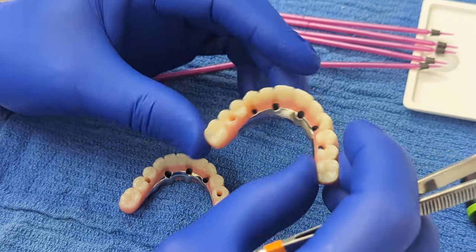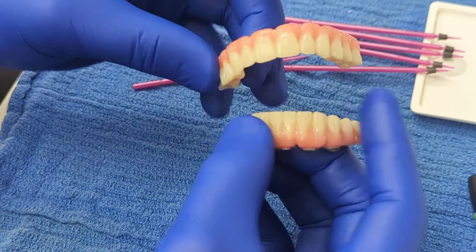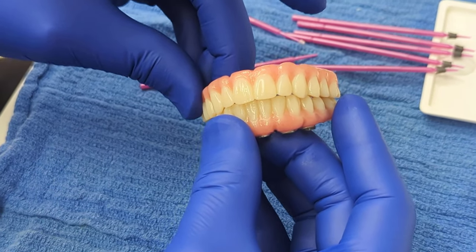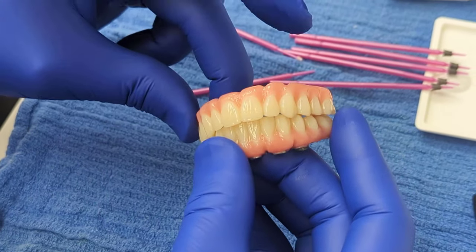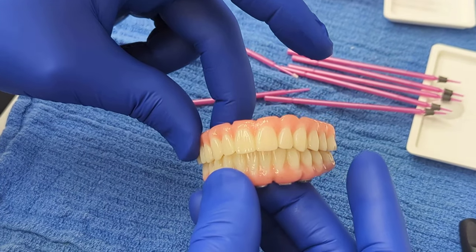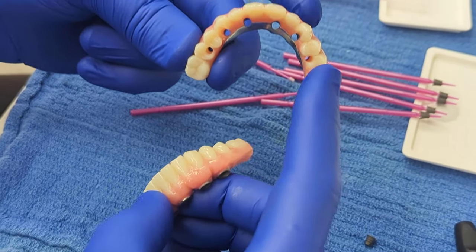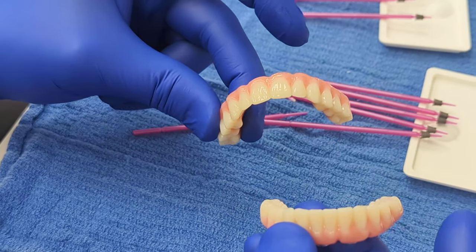Another big advantage. And then lastly, and I could probably go on forever, when we're talking about percussive feel, the feel of these teeth in the mouth is much more tooth-like than it is if these were ceramic materials. That clankiness, that heaviness of a zirconia restoration is really a big disadvantage to those materials. So we also have a better feel. We have a more natural wearability of these materials. You know, even natural teeth wear.